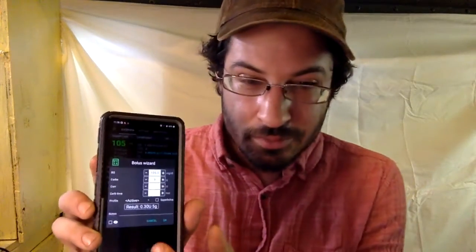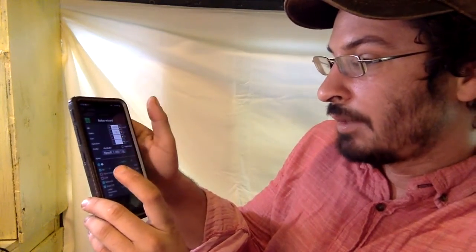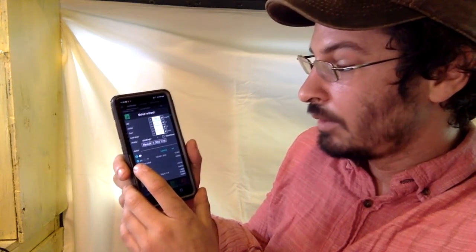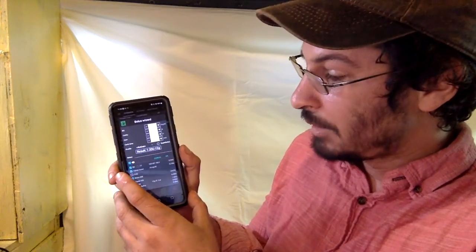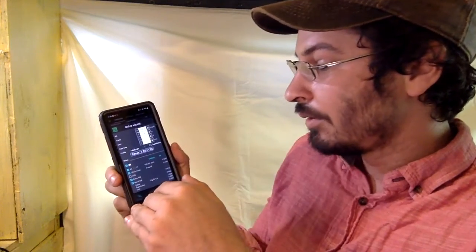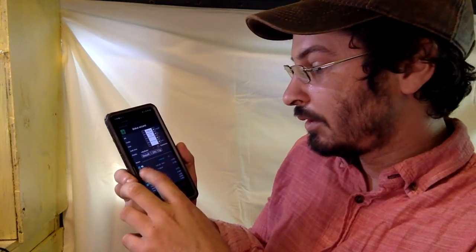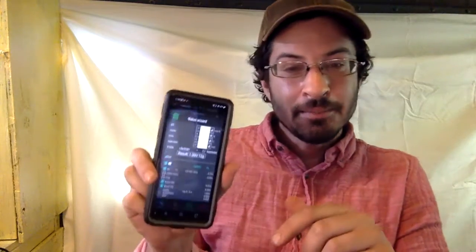And then what's even better, you can press this i here, and you can incorporate other factors. So let's say I'm going to take 12 grams of carbs. It's saying I need 1.3 units. But will that be the same given my 15-minute trend? And what it's expecting is in 15 minutes I'll have gone down 5 milligrams per deciliter, and actually the result should be a little bit less. Yeah, so at any point you check this to see where you're at.